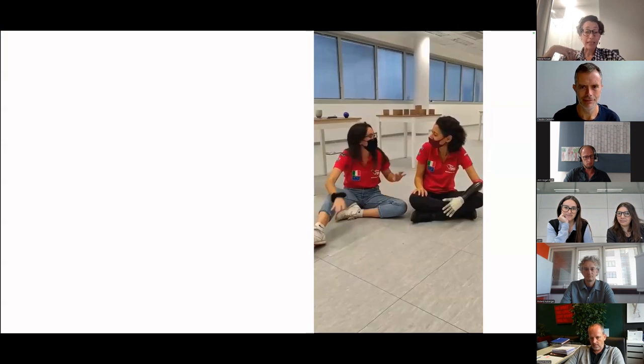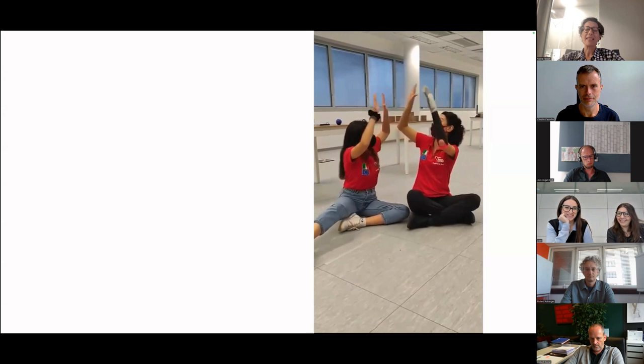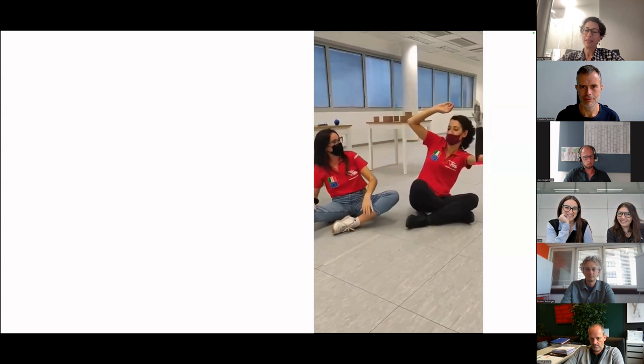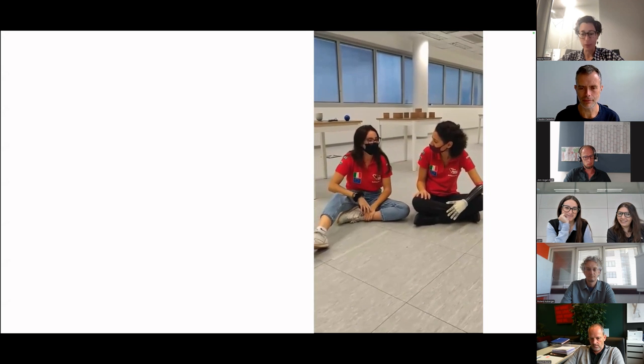social capabilities. Now here you can see in this video that thanks to the softness of the hand, I was able to do this little joke of the bird, of the quiz, whether the bird is alive or dead. And also in interacting with other people, it really showed its great capabilities of being safe and socially acceptable, I would say.